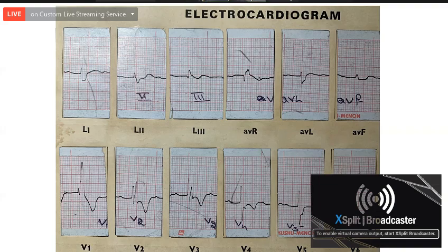What are the causes of a broad QRS complex? Bundle branch block. Aberrancy. Pre-excitation, very good. WPW. Ventricular focus, ventricular ectopics.